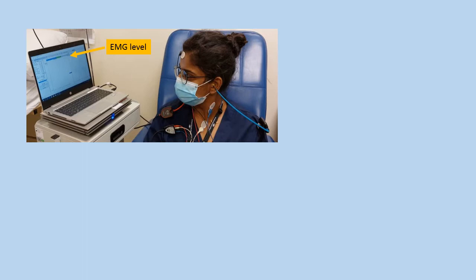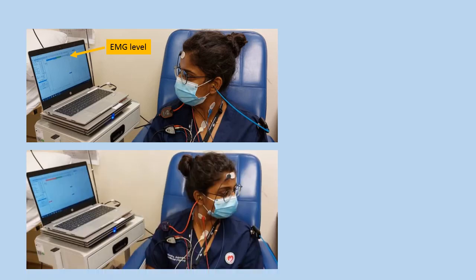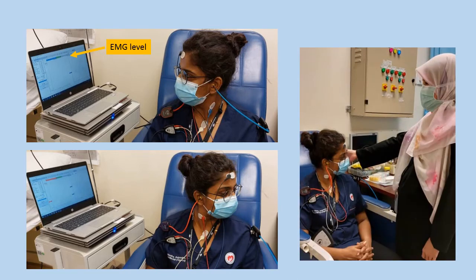In case placing the computer screen with the EMG level next to the subject's headrest is not possible, we may also guide the subject in correcting the muscles by using verbal instruction. Whenever needed, to assist the contraction, we may also instruct the subject to push their head against something, for example, a cushion bar, or simply use our hand and instruct the subject to push our hand during the head rotation, as demonstrated by Puan here.